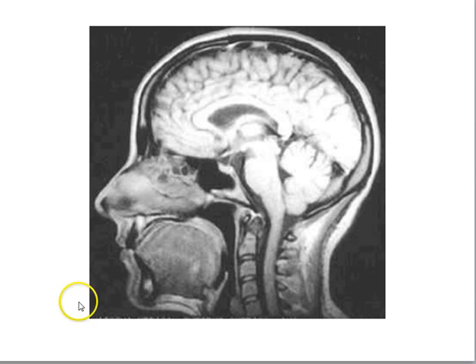But this picture here is only an MRI image. It is not a functional image, so we don't know what parts of the brain are especially active in a picture like this. So this is just MRI imaging of the brain. It's giving you a picture of the anatomy of the brain, and if somebody had a brain tumor, for example, this would be useful for determining the location of the tumor. But this is not the technique that will allow you to look at real-time brain activity. For that, we have to discuss the technique called functional MRI imaging.